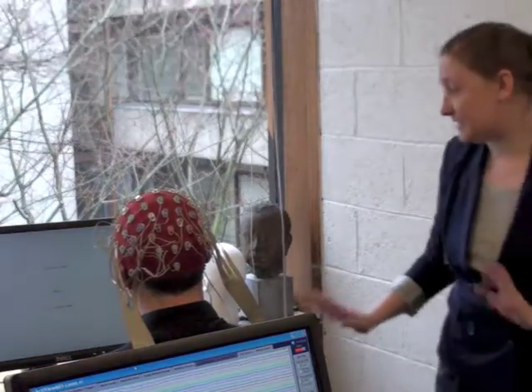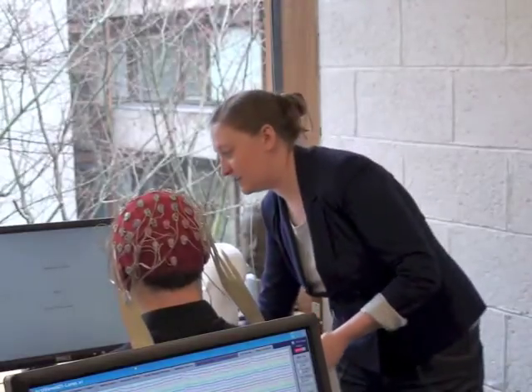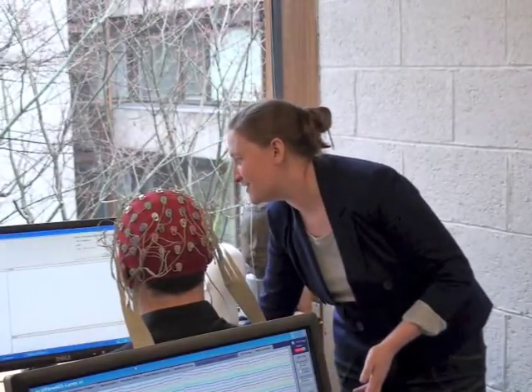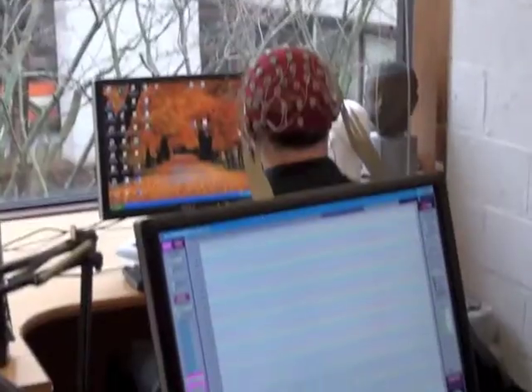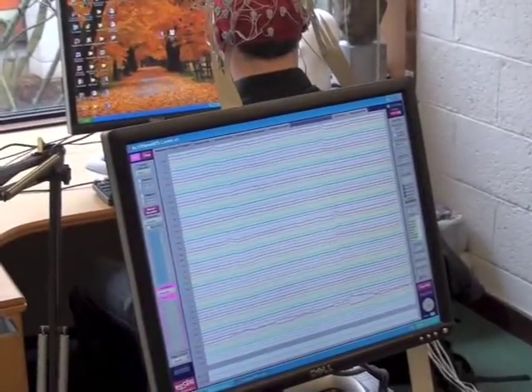Okay, so say this was an hour later and I'd done 4 trials with Bren, talked in soothing tones and sympathised with how hard it all was. Close that. This is all stopped and it's a lot quicker to take off than it is to put on.